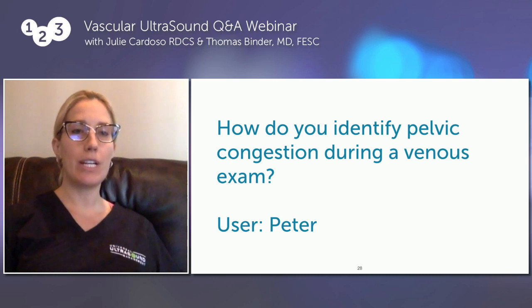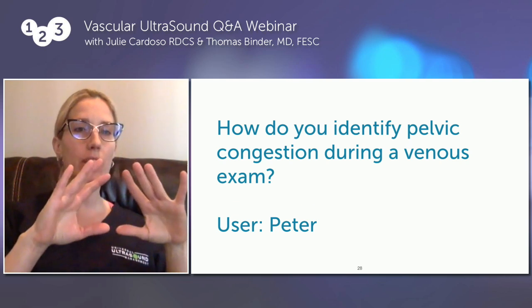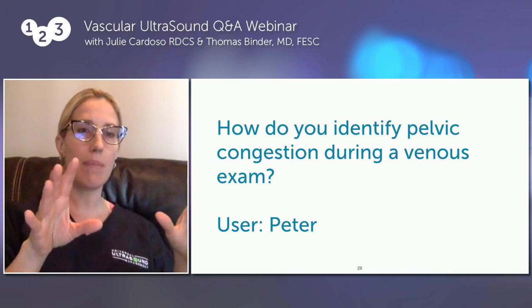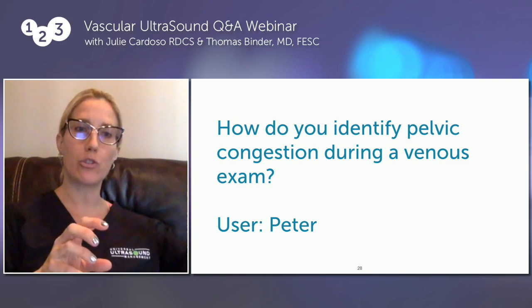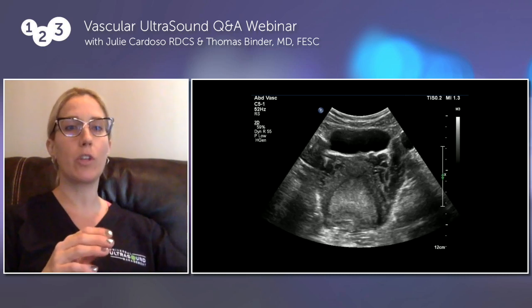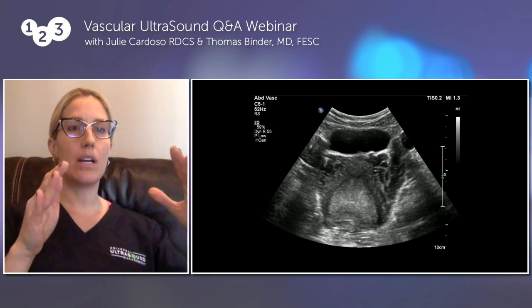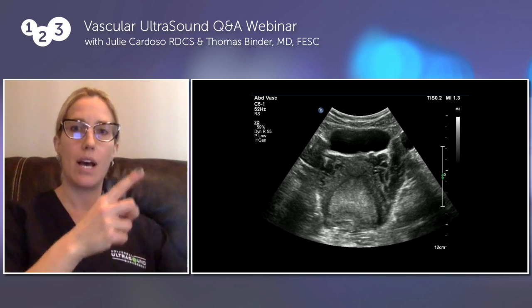But right now, if we're insonating and evaluating the venous system of the lower extremity, it's important that you not only focus on the vessel that you're insonating, but also the surrounding tissue and any vessels coming from any other portions of the leg. Sometimes you will have collaterals or tributaries coming from the groin region going into the saphenofemoral junction. So you want to see if there are any tributaries from there. And also with color flow Doppler, when you are assessing the common femoral junction, you will get reversal flow in the epigastric vein. So this is always an indication of something going on above.